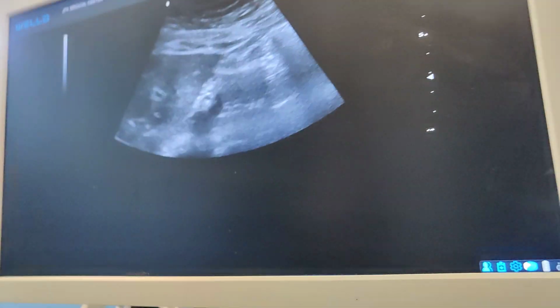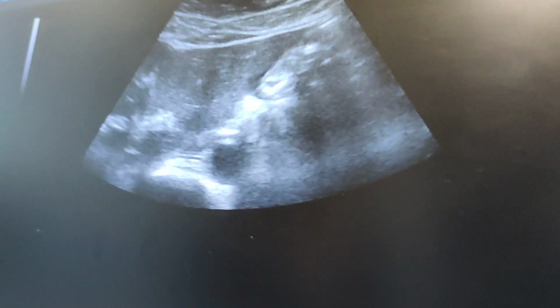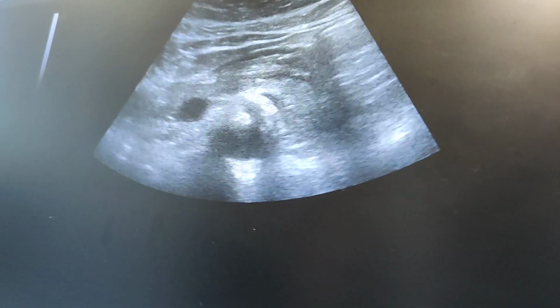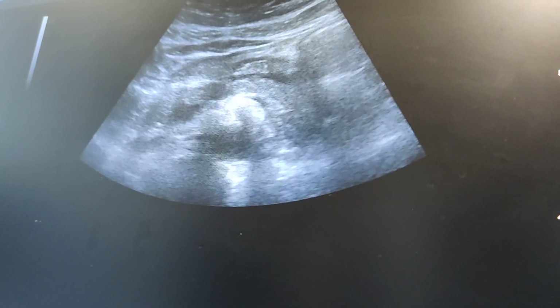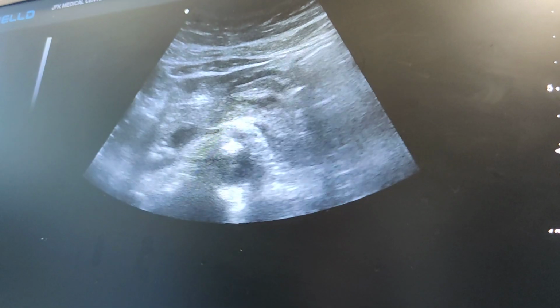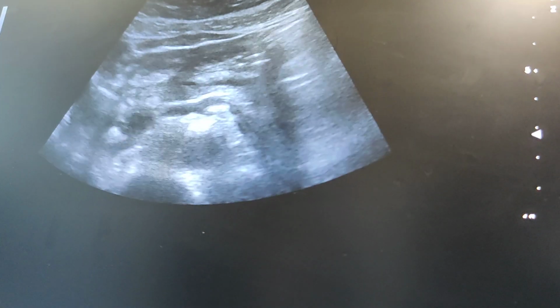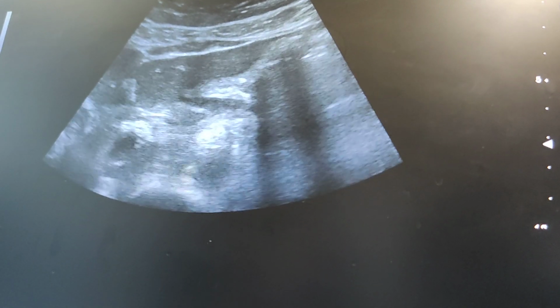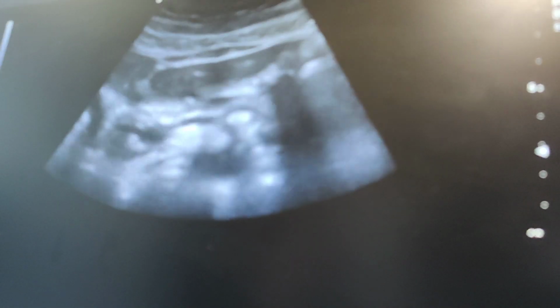Pancreatic tail is typically harder to see with ultrasound than the head or body. So some patients, you may not see it. One trick you can do is have the patient drink a little bit of water. It'll fill in the stomach, and just like the bladder acts like a window for the uterus, the stomach with water in it can act like a window to see the pancreas, especially the tail.